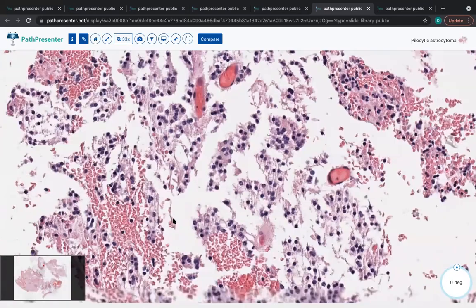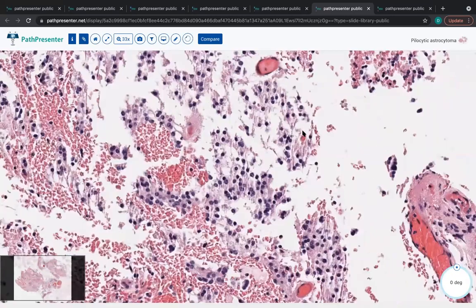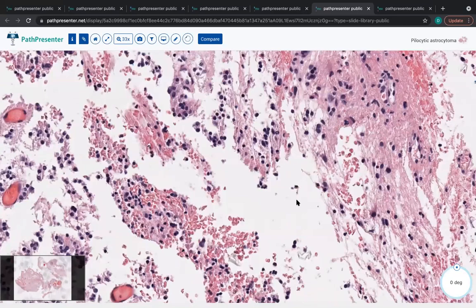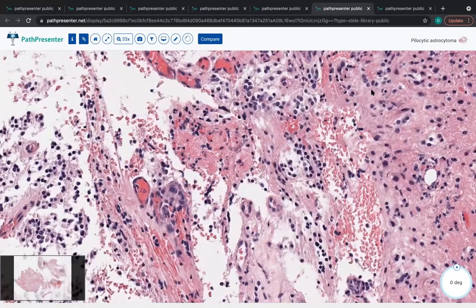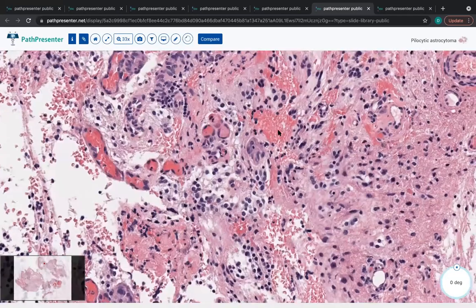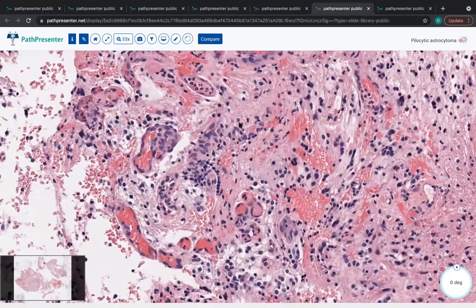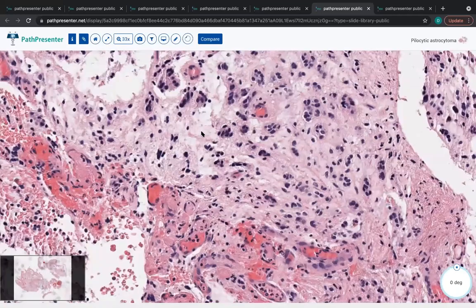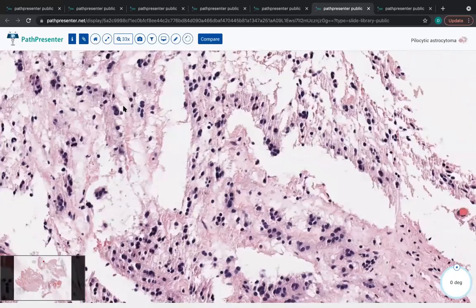What will be your top line in such cases? For the frozen section, what would you write? If I had this very tumor, for instance, I would call it a glioma with piloid features. It has pretty much all of the histologic evidence of a pilocytic astrocytoma. If the clinical presentation fits really well, so this is a cerebellar tumor in a child, I would maybe go a step further and say consistent with pilocytic astrocytoma, confirmation with ancillary molecular testing pending.